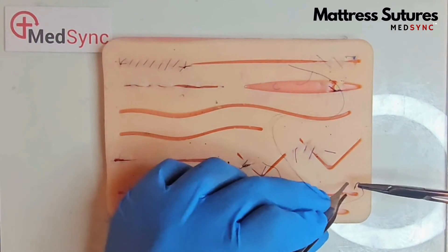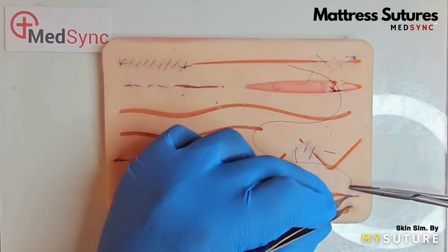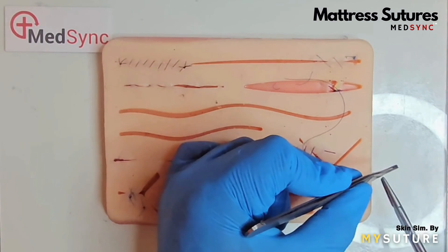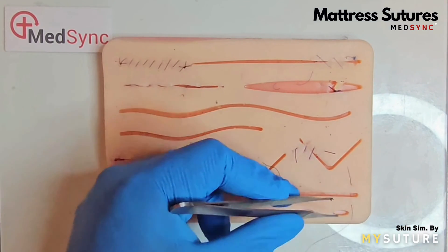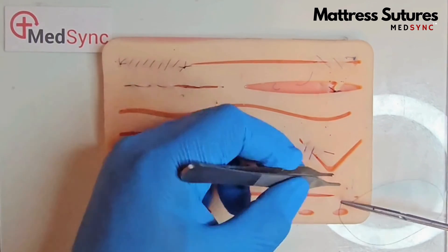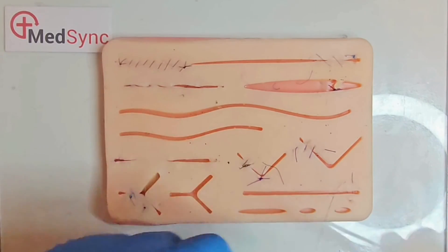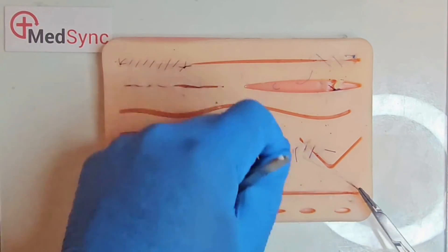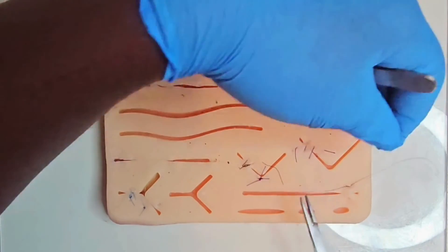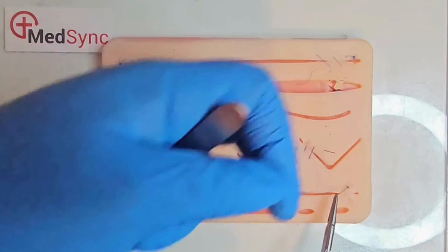The horizontal mattress: you go across the wound like an interrupted suture, but you take two further bites — the third next to the second, heading back across the wound and exiting opposite and next to the first. You perform your surgeon's knot followed by two reef knots. This is excellent for wound eversion.